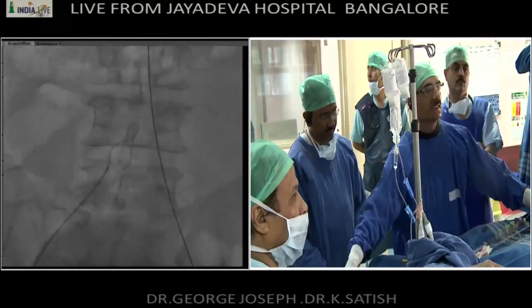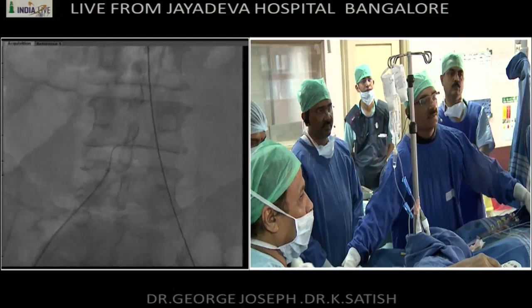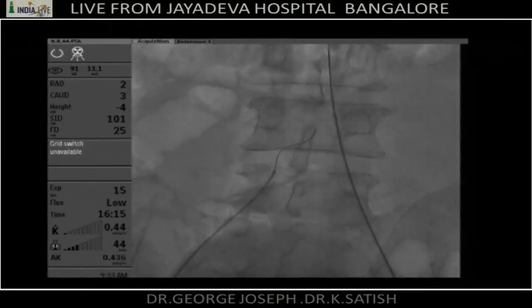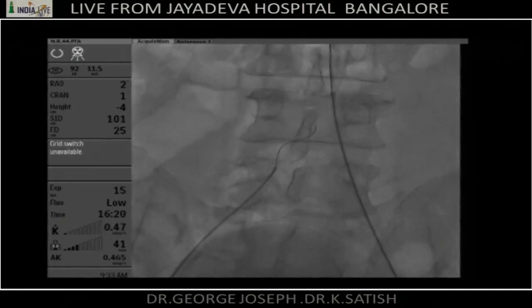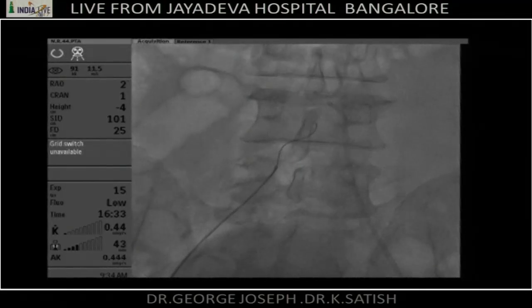I'll keep that as a landmark, and now I'm going to come in from the left groin. I've already got a wire in the left iliac artery going up into the aorta. So I'll use that wire to track another Judkins right catheter, and now I'm going to remove the wire in it, and I will point it towards the proximal cap of that CTO.